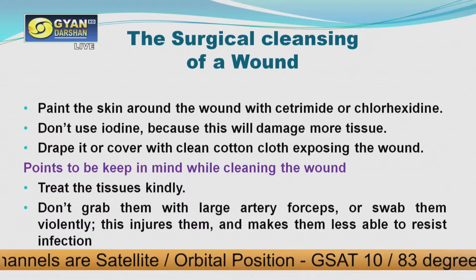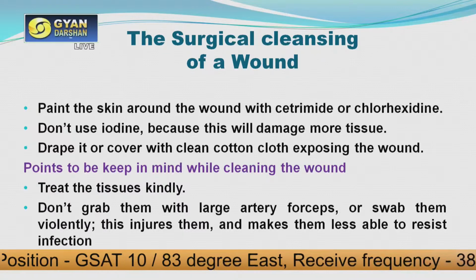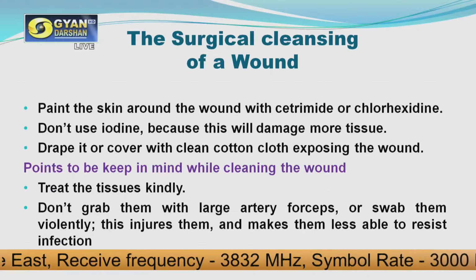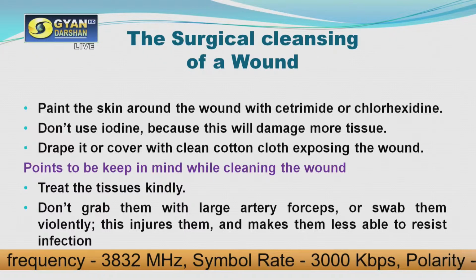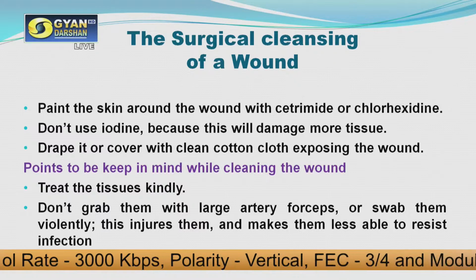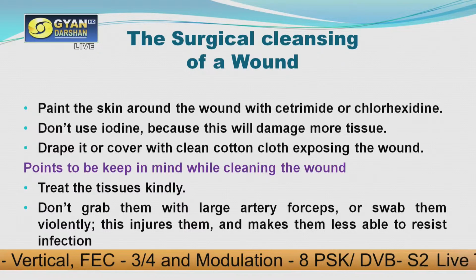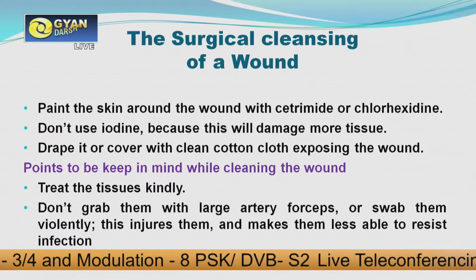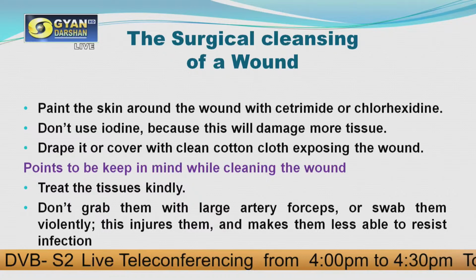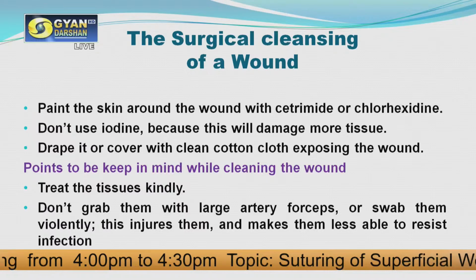You need to keep some points in mind while cleansing the wound, like treating the tissues very kindly. Don't do it in a haphazard manner; you have to clean the wound gently so that you do not give more damage to the patient by your cleansing. And don't grab the tissues with large artery forceps. If the wound is small and you are using an instrument which is going to cause more harm to the patient, that will not be good for the patient.